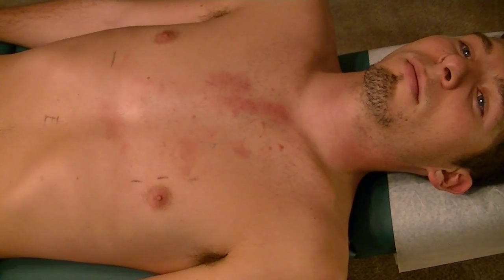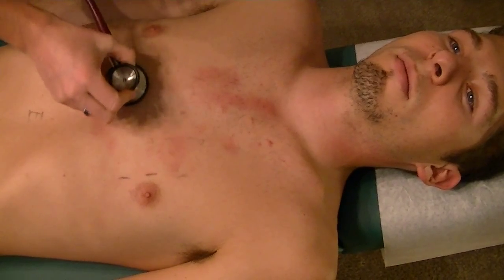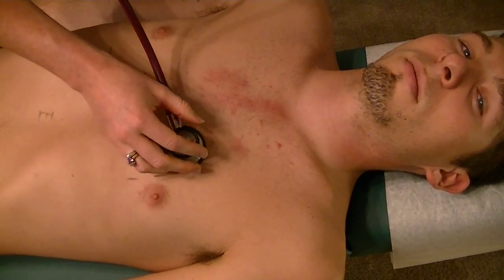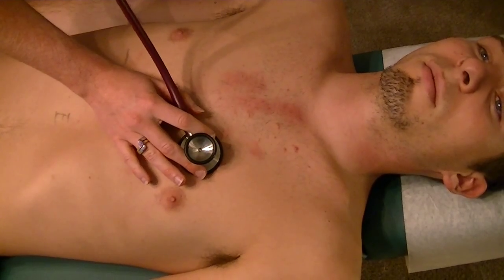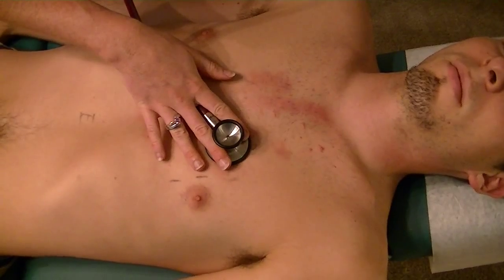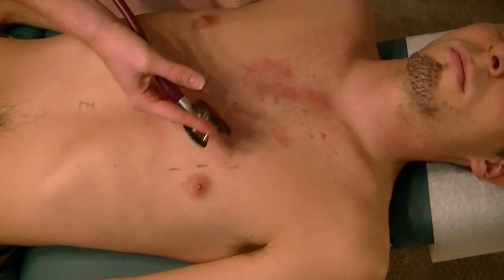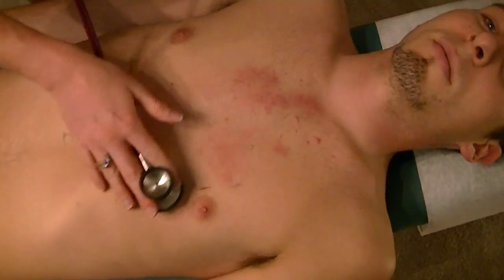So, okay, we're moving on. Now we're moving down to Erb's point, checking for rate and rhythm. Rate and rhythm at beats less than 100 beats per minute. Systole should be shorter than diastole, and obviously diastole should be longer. So here at Erb's point right there, we're using the diaphragm to auscultate APE-TME for general cardiac sounds. So you're checking in all areas, 3 to 5 seconds, moving down in all the general areas.